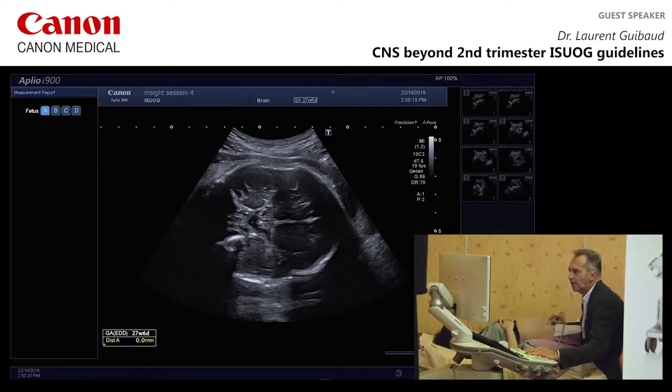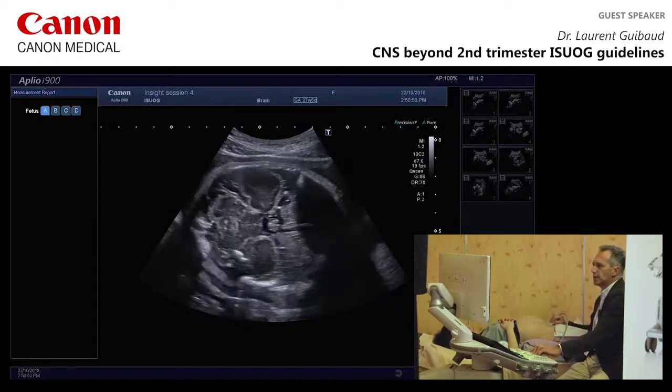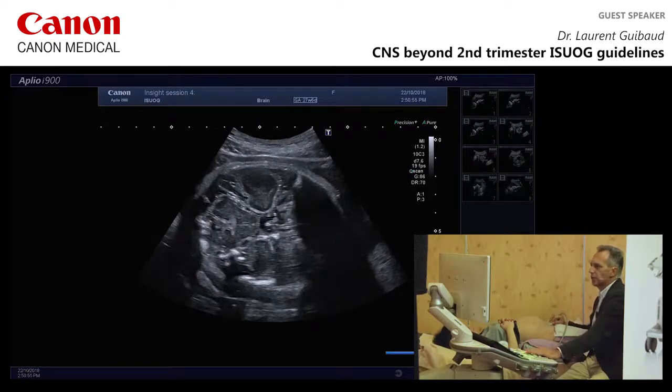In real life, I've never measured the optic nerve on ultrasound. I do an MR, and I never measure. It's a subjective approach, because to have a reliable nomogram of the optic nerve calibers is very difficult. If you ask two physicians to measure the optic nerve, there is a very poor inter-observer agreement. So for me, I can say, yes, there is an optic nerve, they look symmetrical here, but I prefer to have confirmation with my MR, and I most often do only subjective analysis.